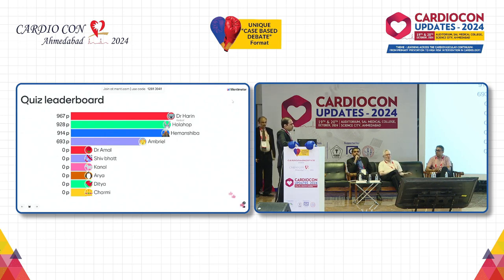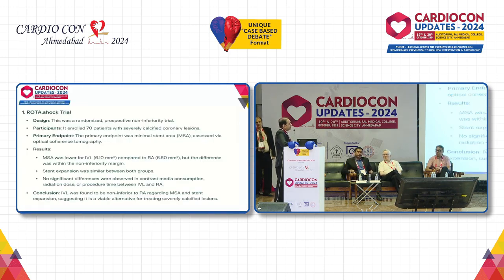So we had the same question, whether we have randomized controlled data sets to compare IVL with rotational atherectomy. There is no benefit in any documented trial, whether you look at the Rota shock trial, which was one of the largest trials, which again probably Mamas touched upon. It was non-inferior to rotational atherectomy, whether you talk of MSA, stent expansion, and hence the reason that it got the approval. The Rota shock trial is the one trial. That's how it got approved in European markets for the therapy.